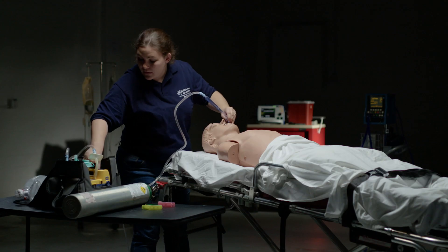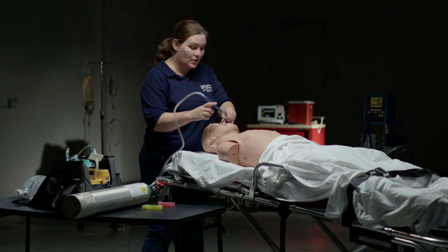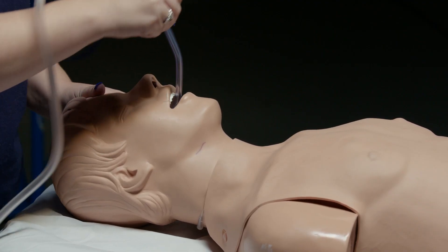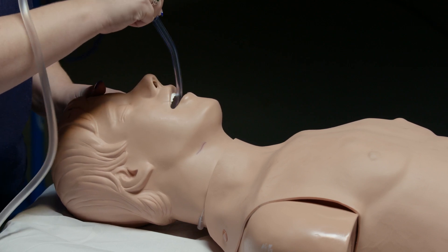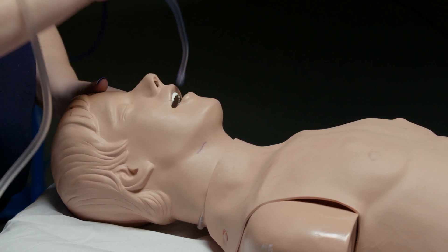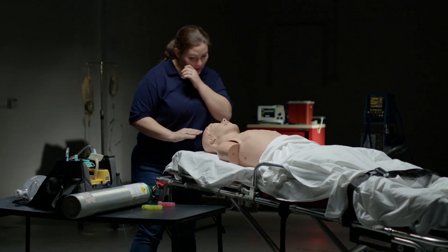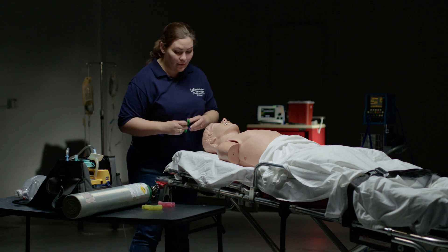I'm going to insert the suction device, turn it on, and apply suction in a circular outward motion for no longer than 15 seconds. The mouth and oral pharynx are now clear.